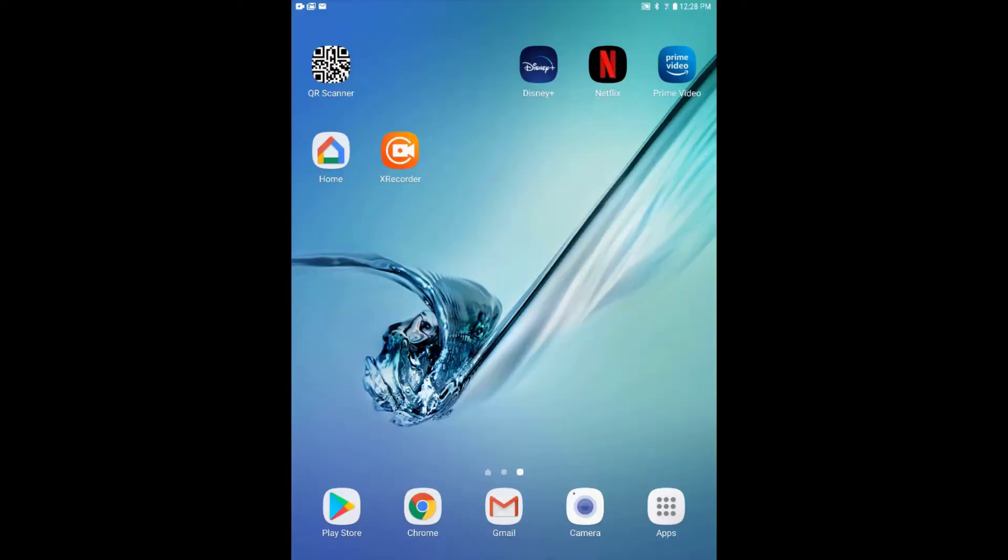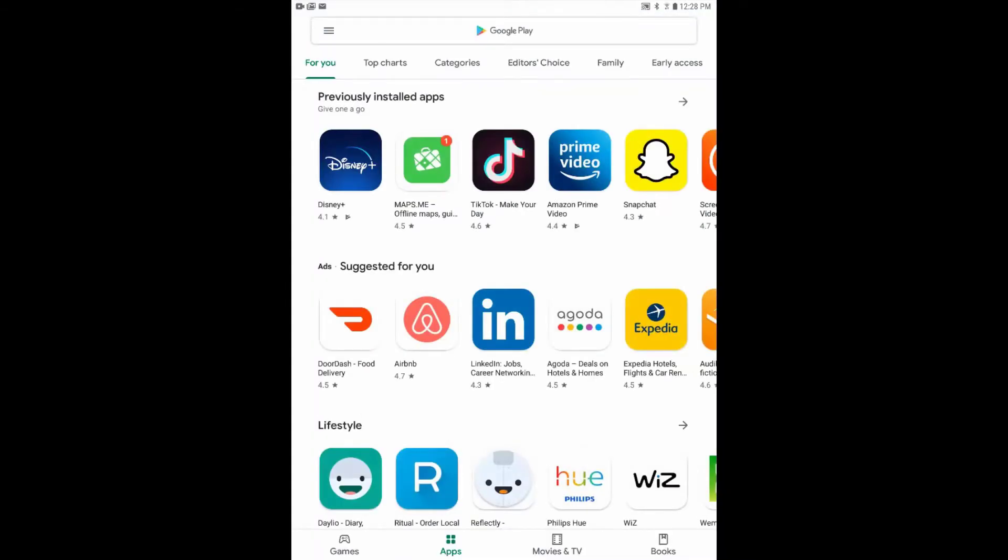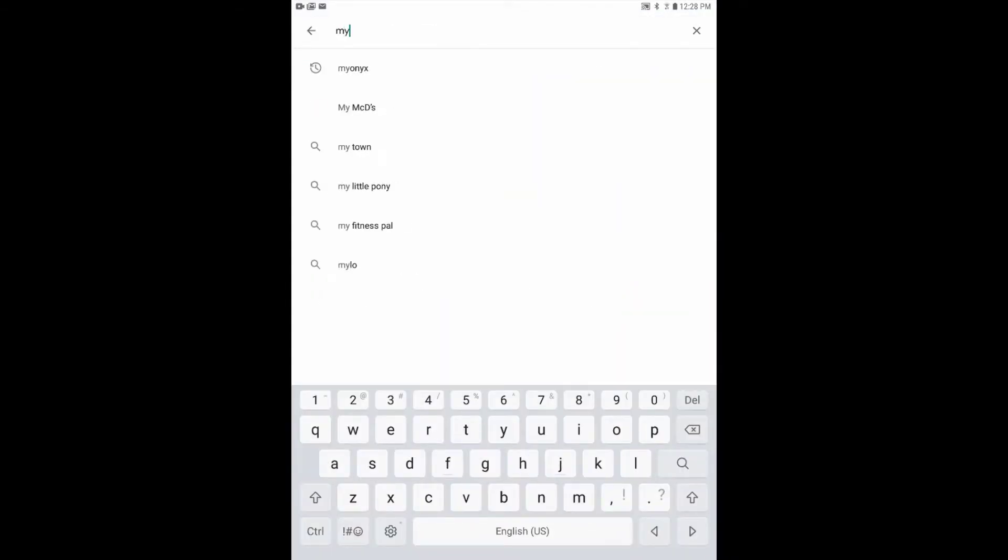You may find the MyOnyx app on the Play Store by either scanning the barcode that came with your device or searching for MyOnyx in the store itself.